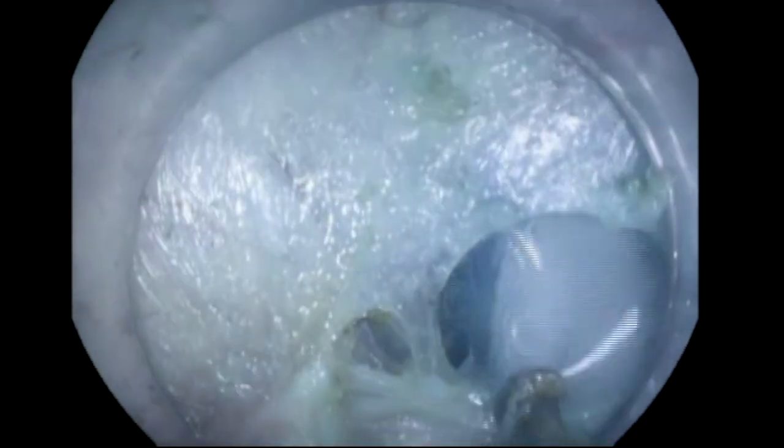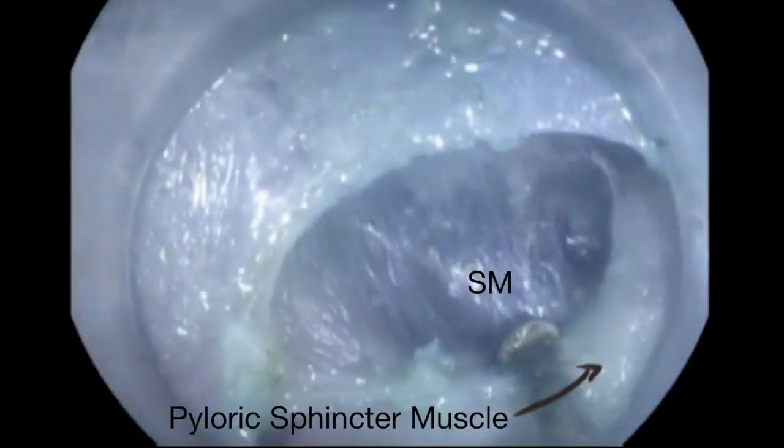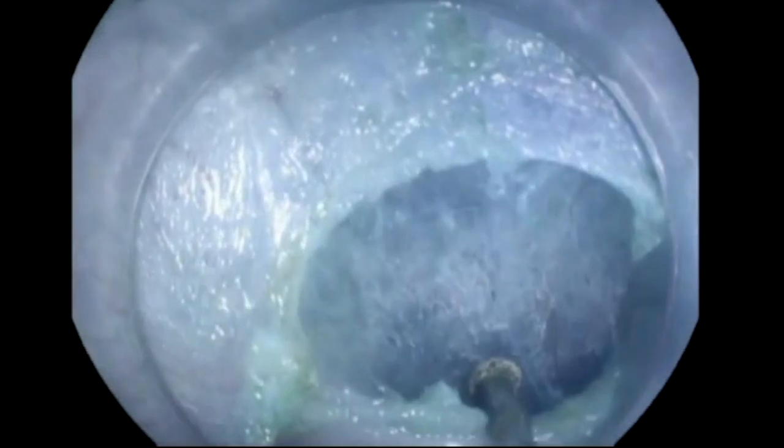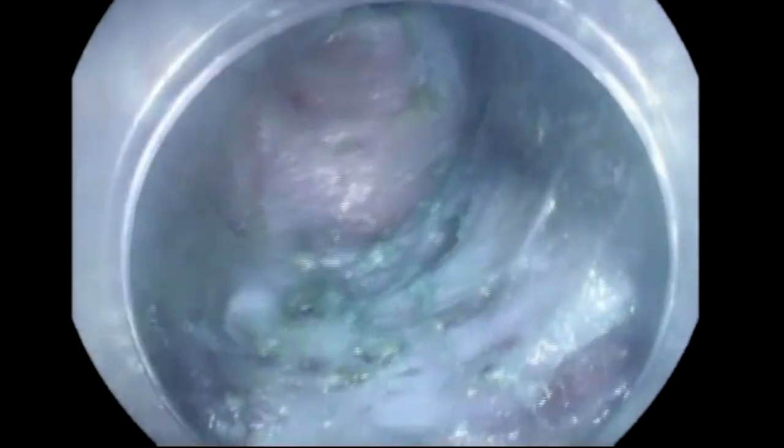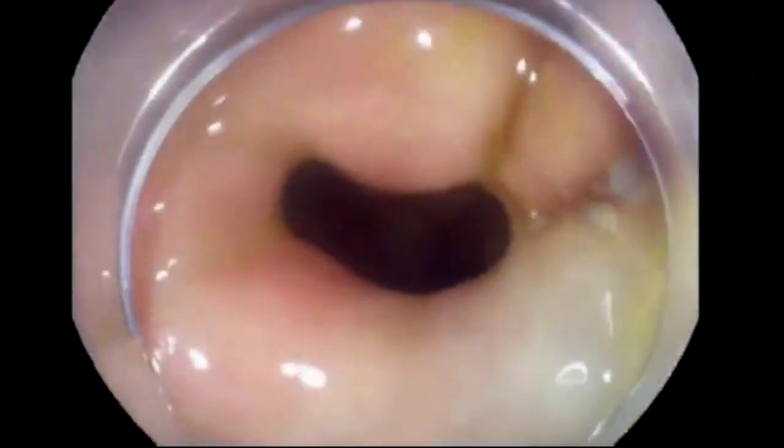The other side, as we see now, is the duodenal submucosa, and the moment I inject water there you can see the expansion — similar to when you are doing a POEM and go beyond the GE junction, it opens up. That's the pyloric sphincter muscle, as you see here, and that's the submucosa. So we know our anatomy very well. We come outside and confirm that we're already beyond the pylorus, as we see here.